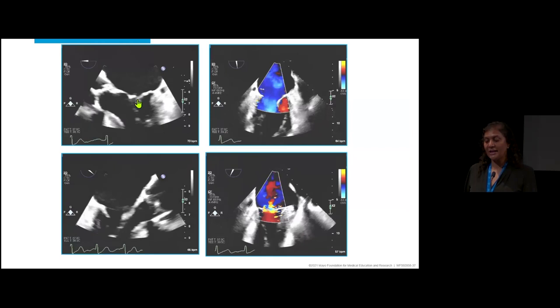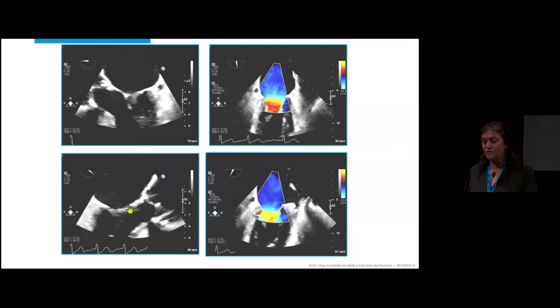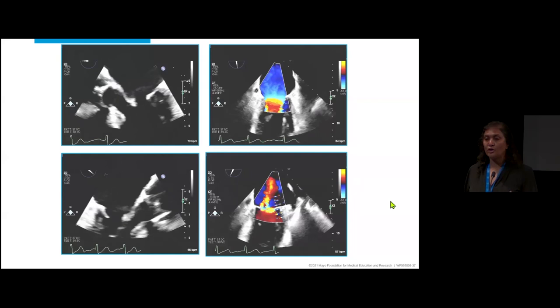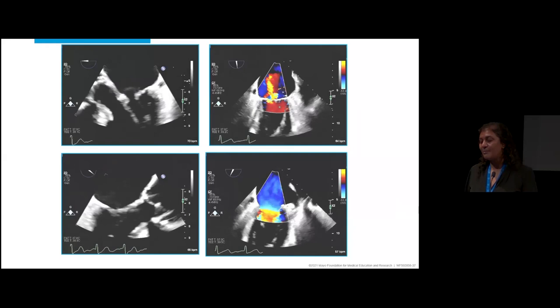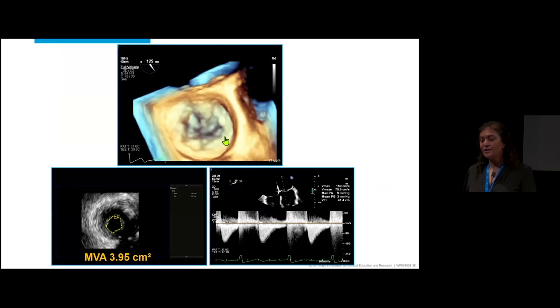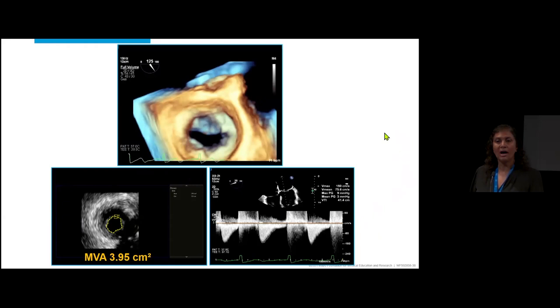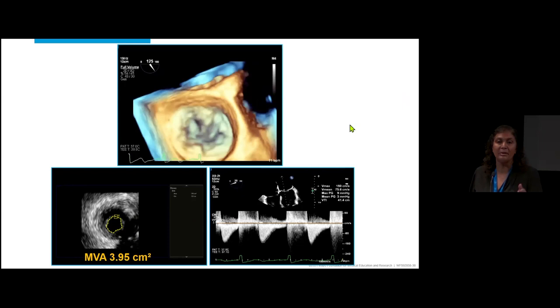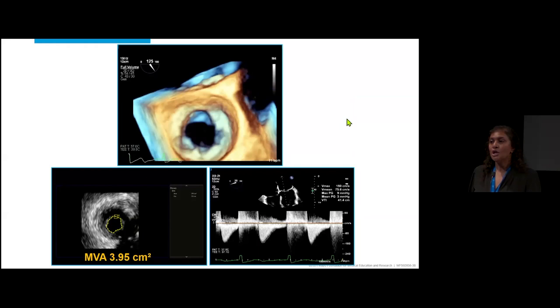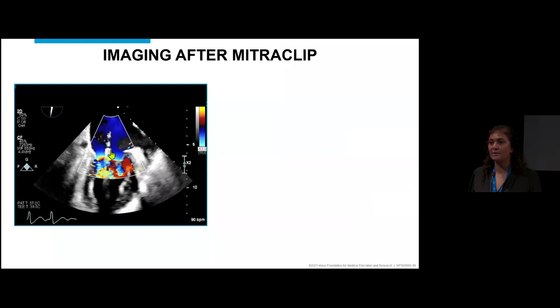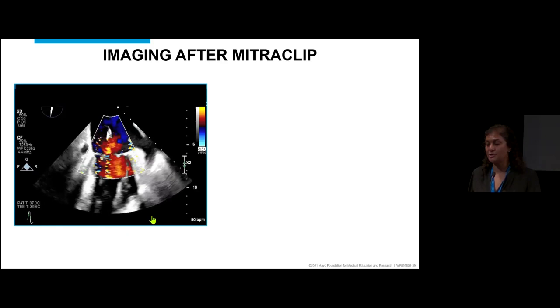At TEE in the cath lab, the mitral valve is thickened — no prolapse, no flail segment — with moderate-severe MR quantitatively, and her LVEF was low normal. On 3D, you see mitral annular calcification circling the valve. The valve area measured 3.95 cm² with a gradient of 3 mmHg. After several measurements averaging around 4 cm², the interventionalist decided to try a clip. Before full deployment with the arms up, the mitral regurgitation had already dropped to mild — a fantastic result for MR reduction.